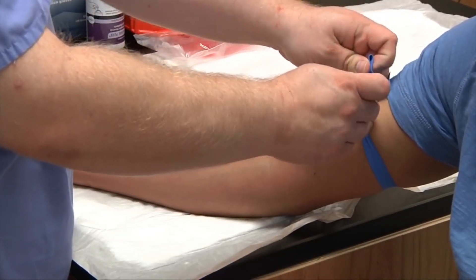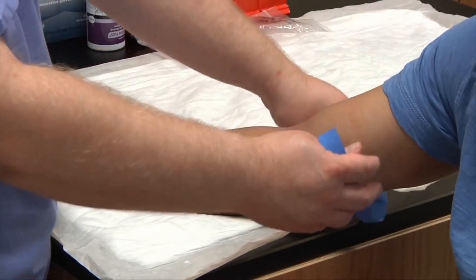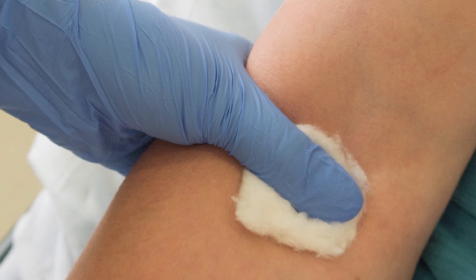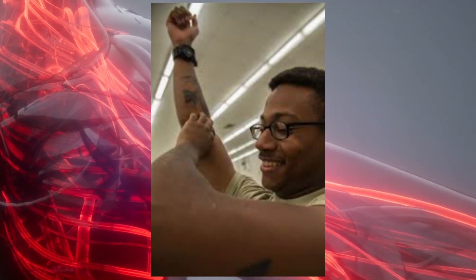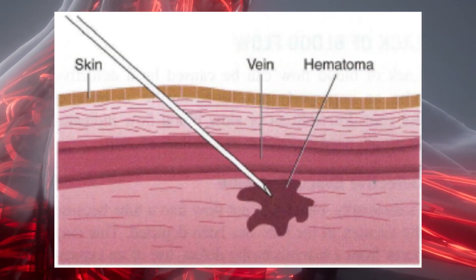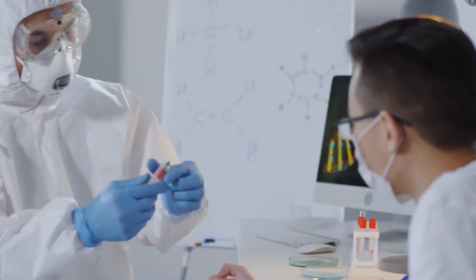Then remove the tourniquet. When the needle is out of the arm, press gauze firmly on the puncture site. Have the participant raise their arm and continue to hold the gauze in place for several minutes. This will help to prevent hematomas.